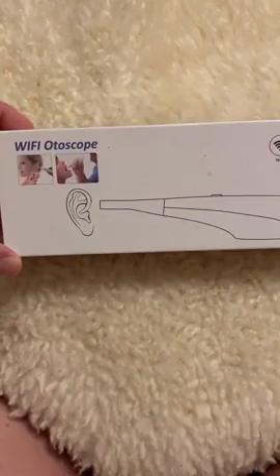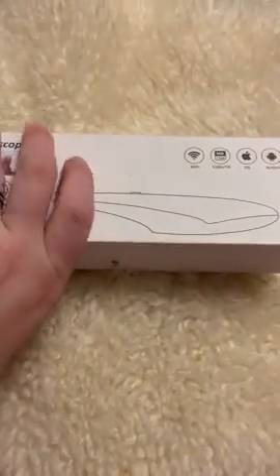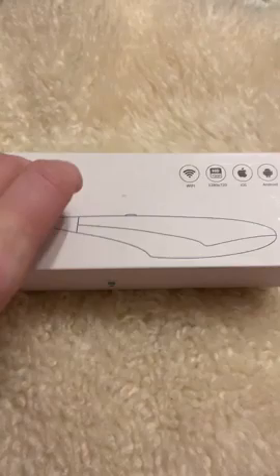I'm doing a little unboxing of this Wi-Fi otoscope — I think it should be in every mom's first aid kit. I got it off Amazon, I love it. My kids are starting to get into everything, so we thought it would be something good to have on hand.